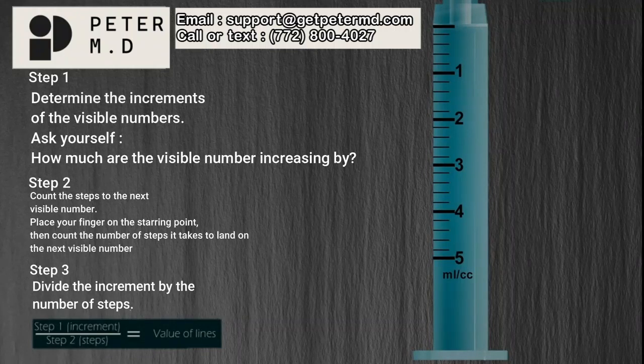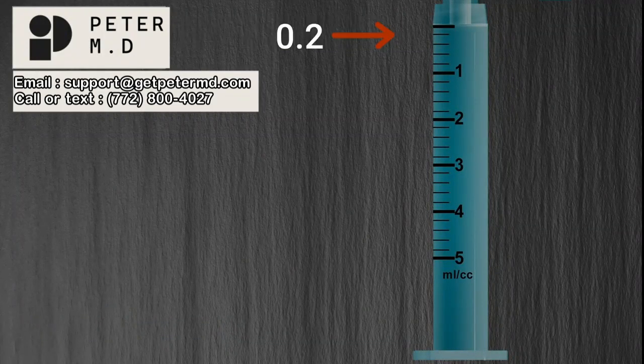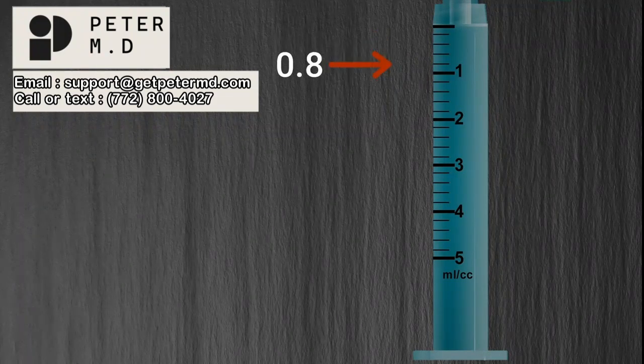Step 3: Divide the increment by the number of steps. Divide the answer from step 1 by the answer from step 2. When the increment of 1 is divided by the number of steps, 5, it equals 0.2. Therefore, each line on the syringe represents a value of 0.2. That means this line indicates 0.2 milliliters, this is 0.4, 0.6, 0.8, 1, 1.2, 1.4, and so forth.